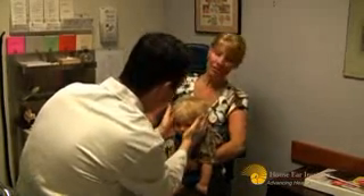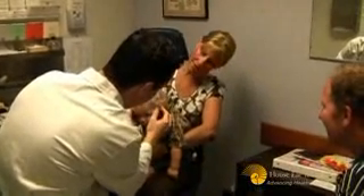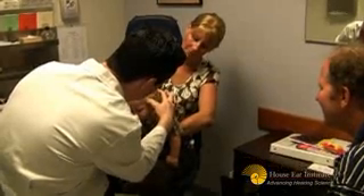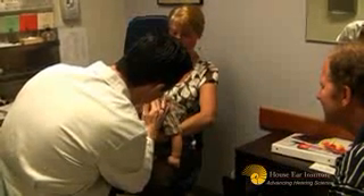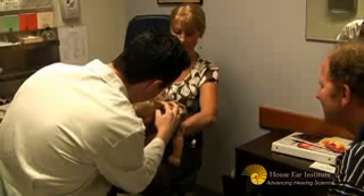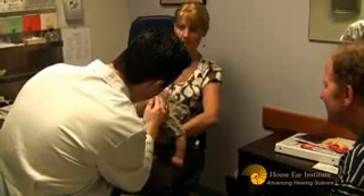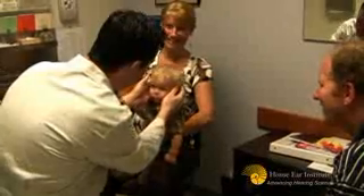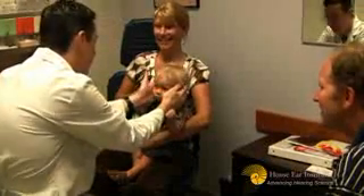Now the implants are going to go under the muscle, under the skull — but behind, because we've seen some that are way up. They're going to be behind. The magnet is going to go right about here. The implant will come right here, and then the magnet will go here, and then he'll wear the processor like this. And how do you get them even? Well, I always put implants in exactly the same position, but we'll try and get them as even as we can.